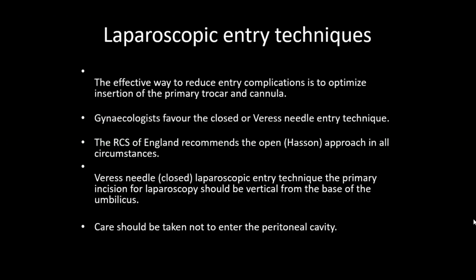The peritoneum covering the course of the inferior epigastric will still be intact, and the blood vessel will be injured and retracted. So in post-operative follow-up, this patient sometimes suffers from hypovolemic shock, and only a subrectus hematoma will be your landmark for inferior epigastric injury. So the inferior epigastric is a very tricky artery. You should take care of it, actually.